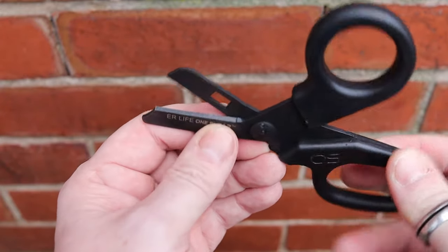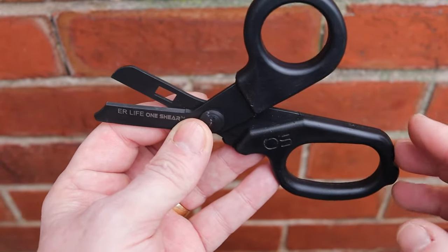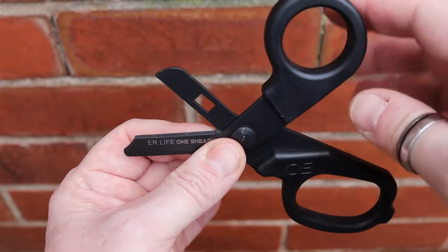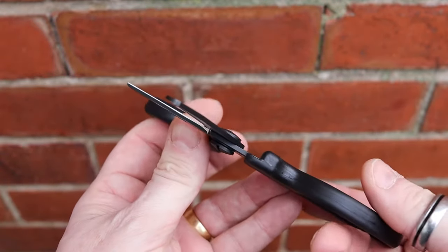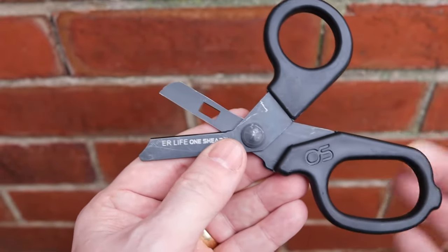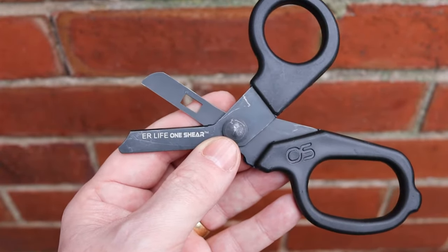There is a rounded tip at the end — it's completely rounded at the edge. You then have the cutting surface: the bottom set of jaws, which generally don't move, are serrated with a really quite aggressive serration. When you're trying to cut things you don't get any slippage — it's really good at holding the surface so you can use the other arm to cut through. The top jaw is the non-serrated side.